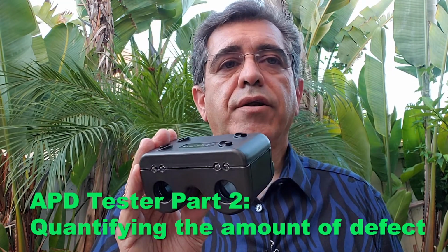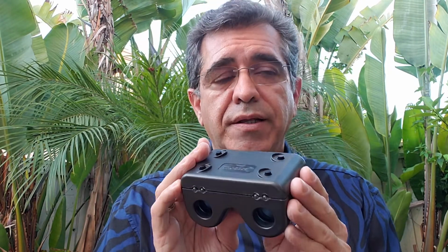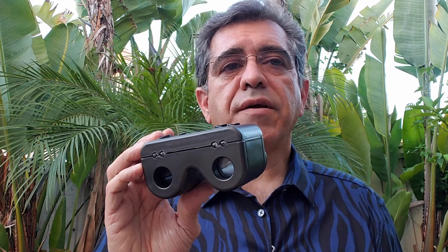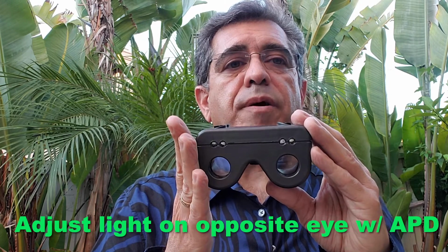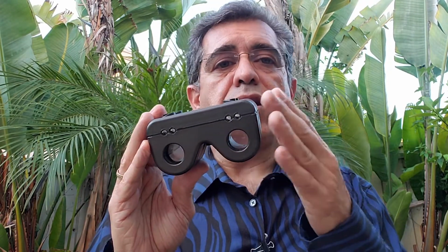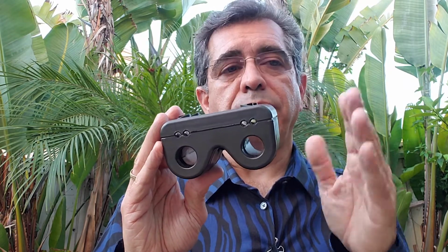The APD tester can also help quantify the amount of the APD defect. The LED lights can be dimmed in steps. The levels are calibrated to the same level as standard neutral density filters. So if you detect the positive APD for the right eye, then you would start dimming the light corresponding to the patient's left eye. You would keep going until you reverse the APD. Then you go back one step at a time to find the best level where there is no APD.